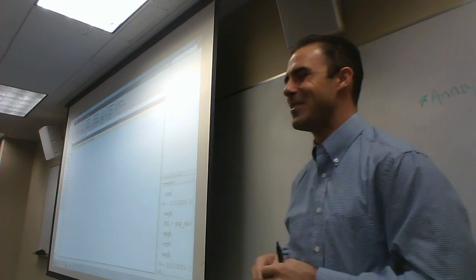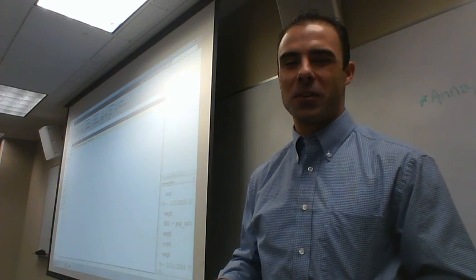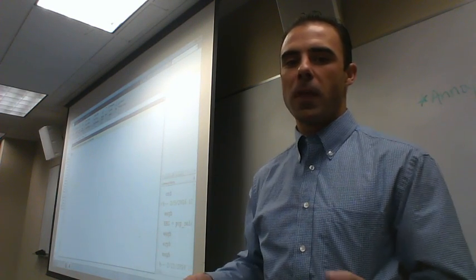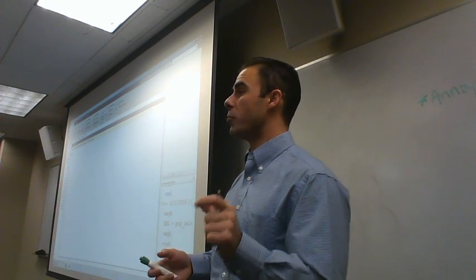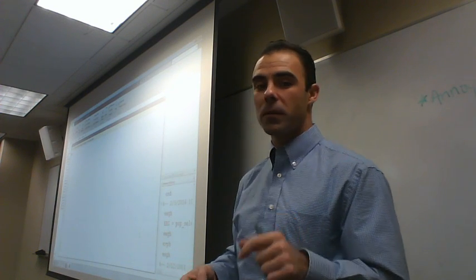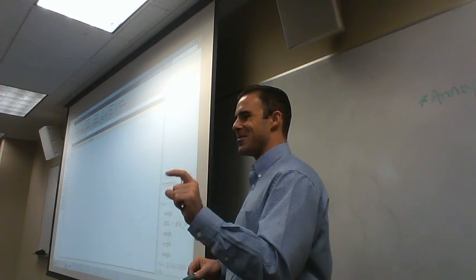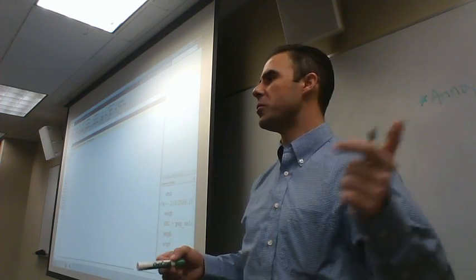Let's talk a little bit about the quiz. The first question we had is, if you wanted to create a difference wave between ERP conditions, what text file would you use? Would it be the events list or the bin operations file? And which of those text files is used first in the normal sequence? The first answer would be bin operations.